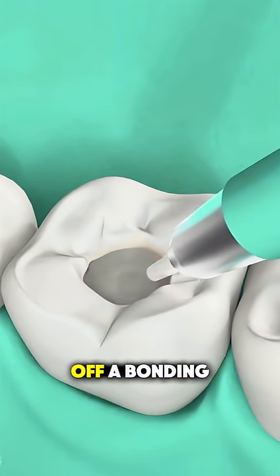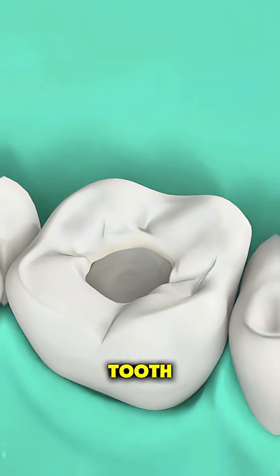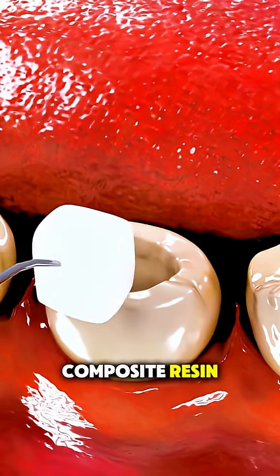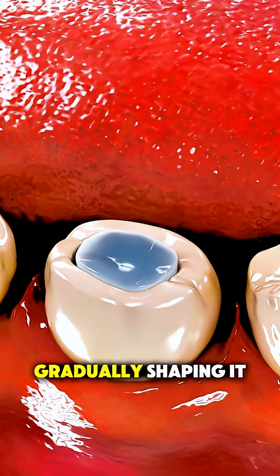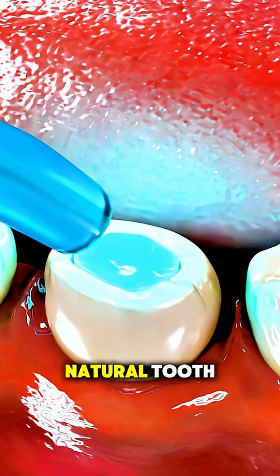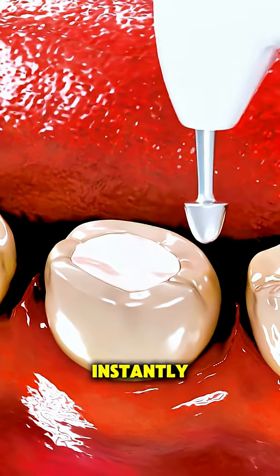After rinsing that off, a bonding agent is applied — kind of like glue for your tooth. Now comes the composite resin. That's the tooth-colored material. The dentist layers it in gradually, shaping it to match your natural tooth. With each layer, they use a special blue light to harden it instantly.